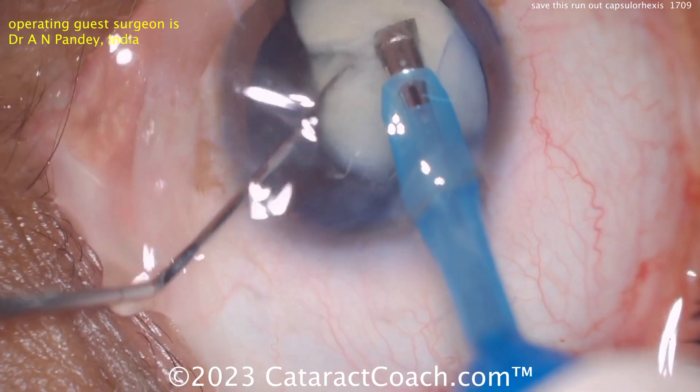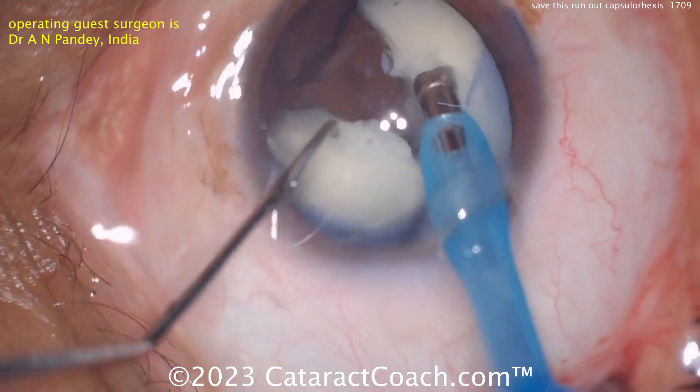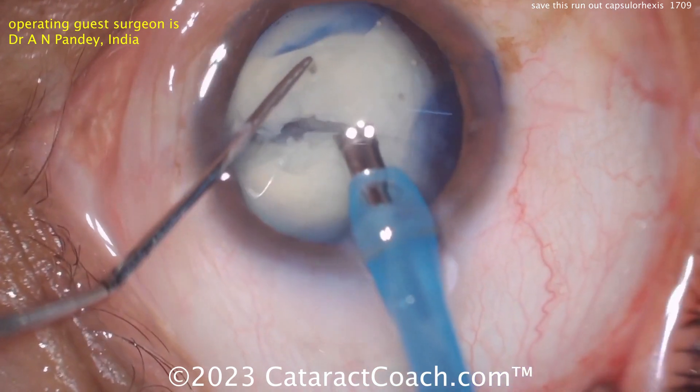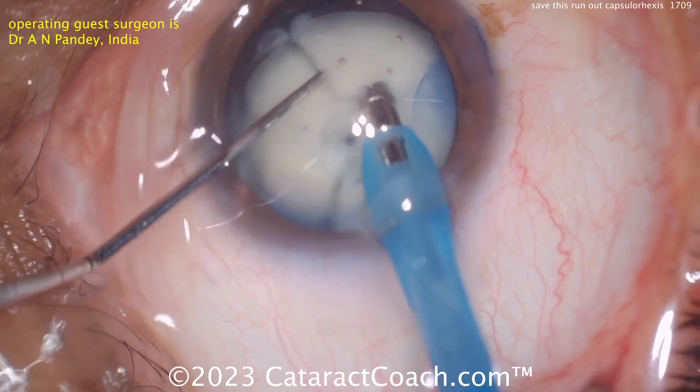Hopefully the capsule is still intact. Let's see — this nucleus can be chopped. The central core of the nucleus has some density to it. Do you see how empty it looks now? I think after the first rexis was done, a little bit more flushing out of the liquefied lens cortex would have been a good idea.